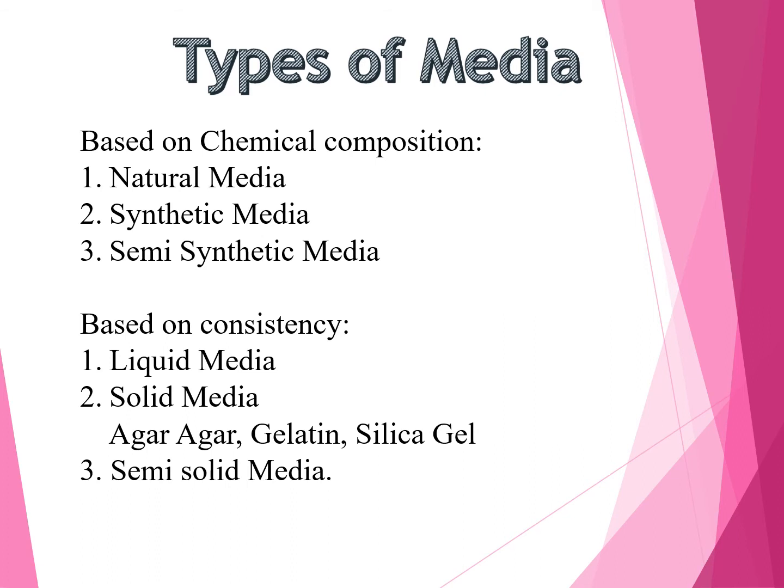In the synthetic media, the exact chemical composition of media is known, so they are called synthetic media, like MS media. And in semi-synthetic media, the chemical composition of media is partially known, such as PDA, that is potato dextrose agar.